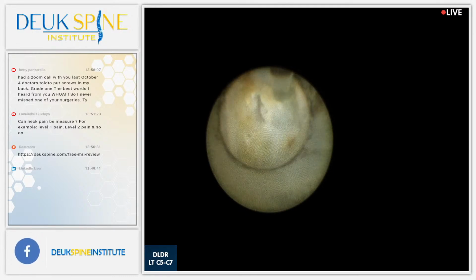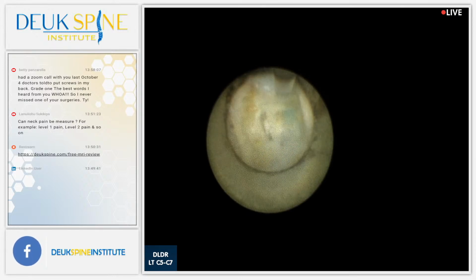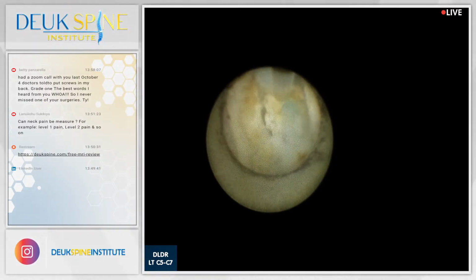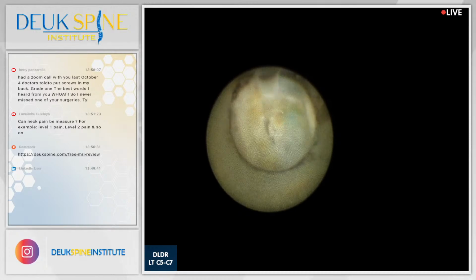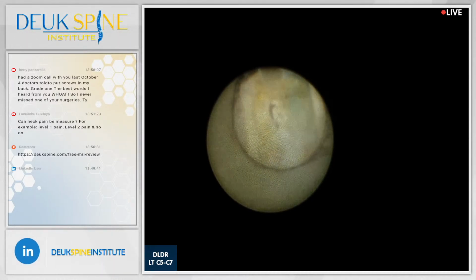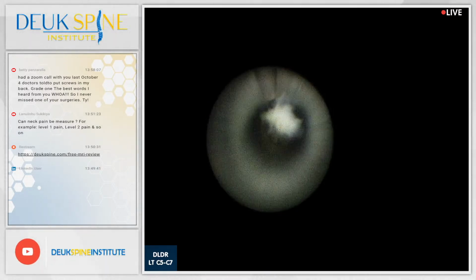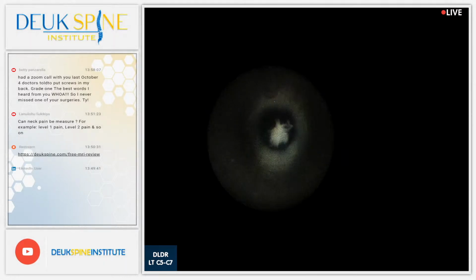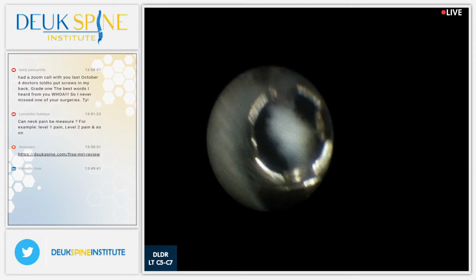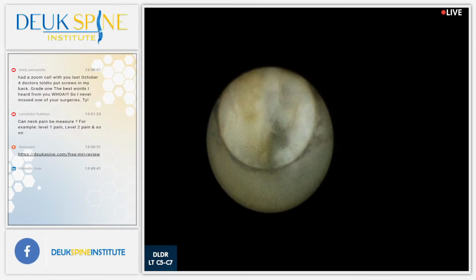Hello, Steve. Welcome. First question they asked is, when you are doing this procedure, are you cleaning up the extruded material on the outside of the disc, the inside surface of the herniation within the annulus, or both? Both, Steve, both. Great question. You are correct. We are literally going inside the herniation and attacking it from the inside and zapping away the herniation, one layer at a time, till we get to the outermost surface. Does that make sense?